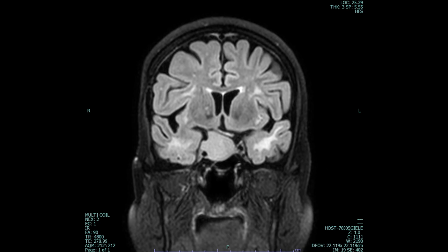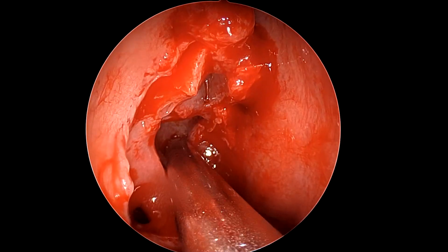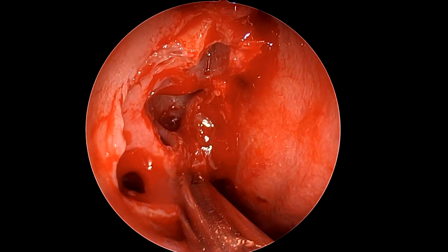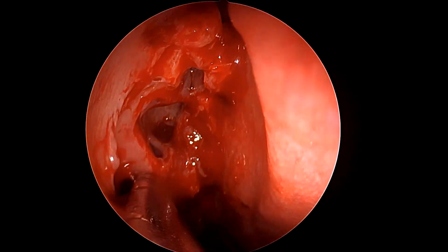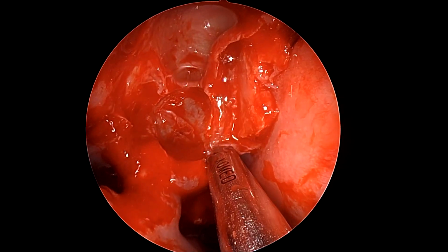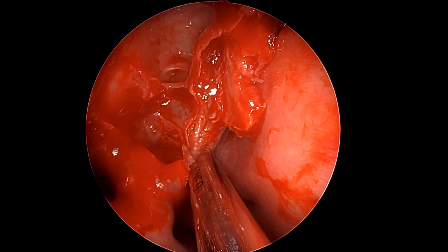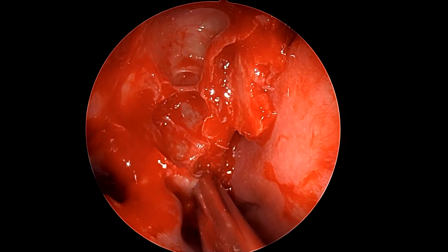On examination, we see a large sellar mass with suprasellar extension with a Knosp 2 to 3 classification, that is partially going around the cavernous carotid, not completely encircling it. The tumor plane with the carotid is still maintained. There is no wall irregularity or compression. And with the right eye already blind, we pick this patient for a revision surgery, transnasal endoscopic binostril.